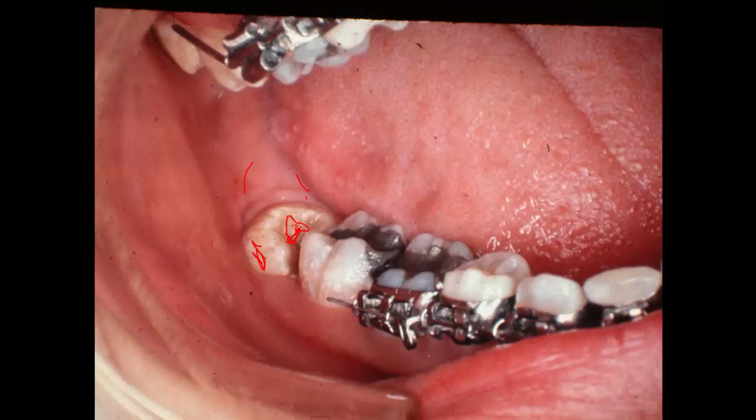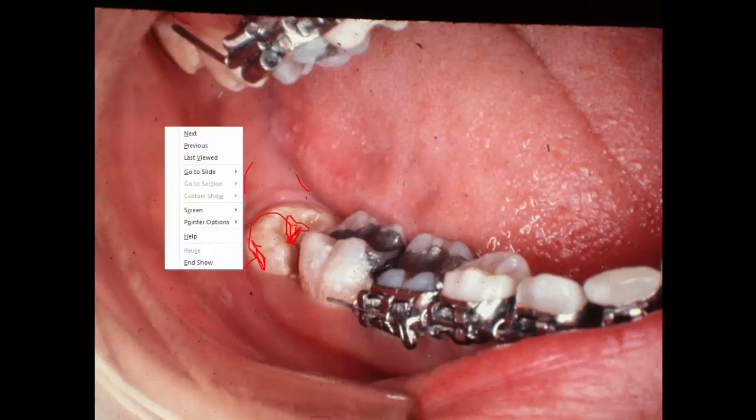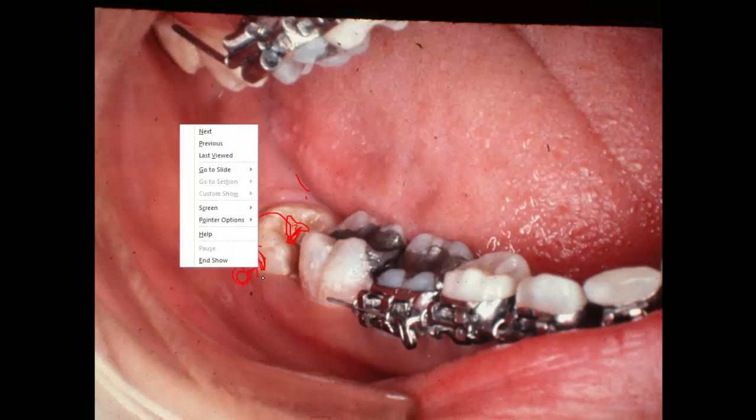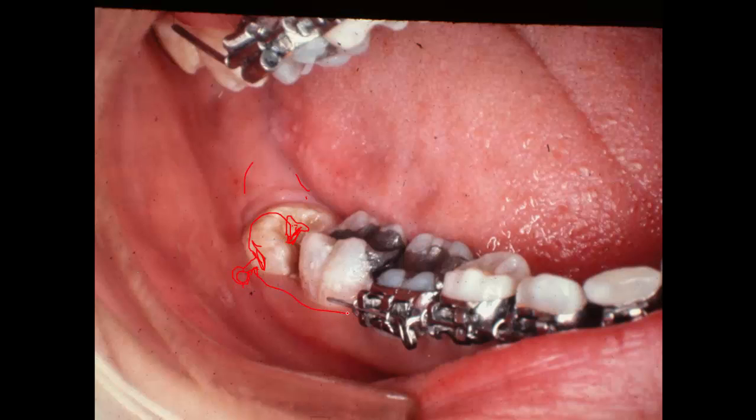So I bonded a little wire down in this part of the tooth, and it came around over here and then made a spring, you see, that we would bend down, and this spring went out and something like this, and then came back up and hooked it over here, and the spring was working just like our tube over here, but it was bonded to the surface of the tooth right there, and it's going to take this tooth out of there, and I'll show it to you just another slide or two.